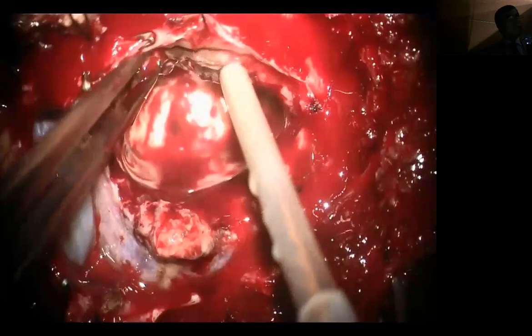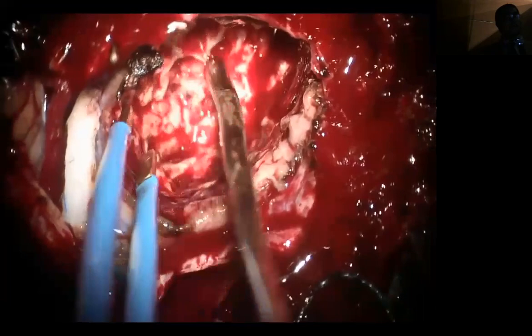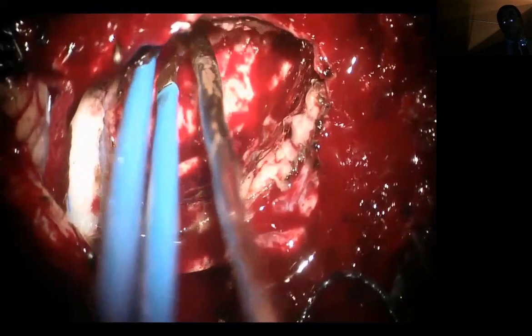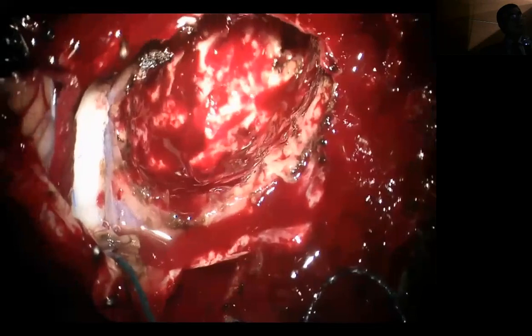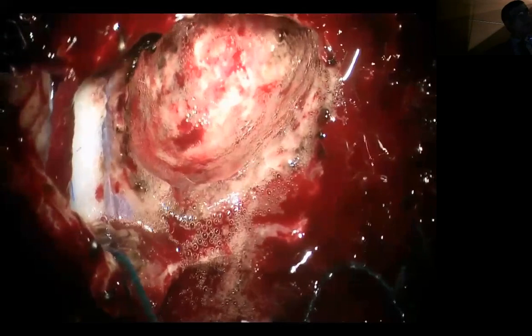The first minute we get the specimen, we send it for a frozen section, and we continue. Again, if I'm there, I'd like to take as much of the lesion as I can. Is it well encapsulated? No. So this is the cavity left. And we do hemostasis. We put this hydrogen peroxide, which would coagulate any small vessels, and it kills anaerobic organisms. And then we put Surgicel as hemostat. Okay.